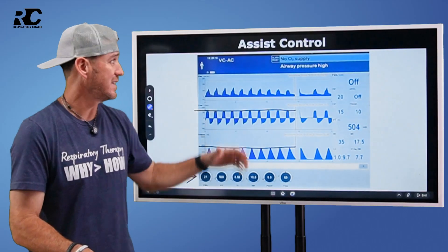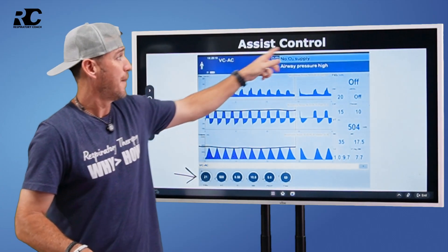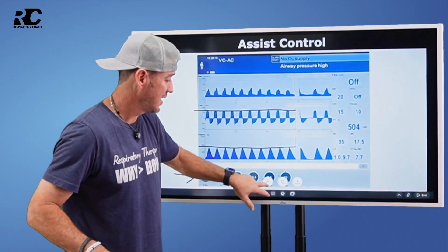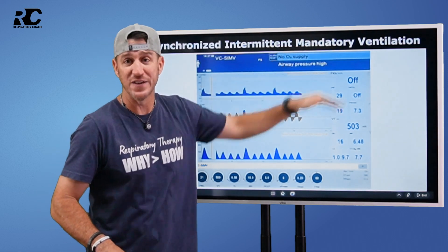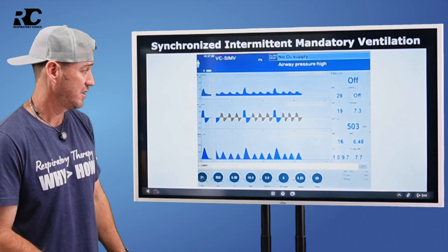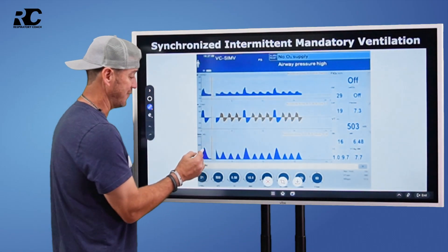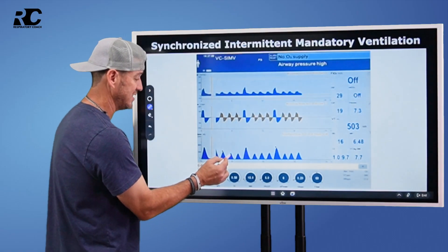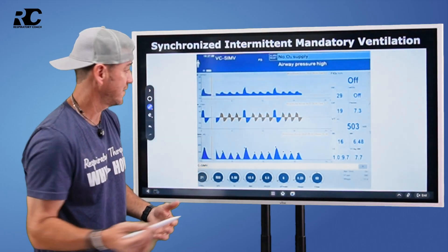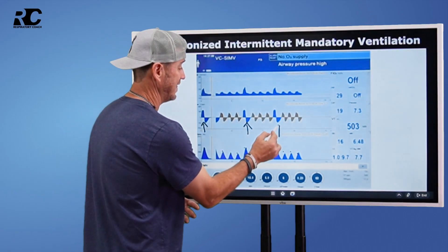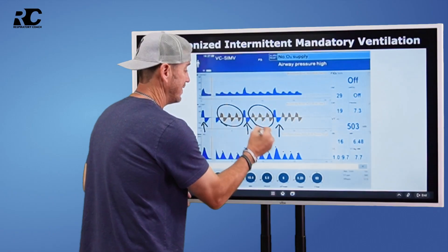Hopefully that makes sense. Think about the name — the vent says, oh, you want assistance, you want a breath? Okay, I got you, but I'm in control. Now watch what happens when we look at SIMV, which stands for synchronized intermittent mandatory ventilation. Look at this image — it looks different, right? When we look at this, what we find is we've got a volume here, a volume here, and a volume here. What's going on with these volumes? Why are they different than the others? Look at the flow pattern — these all look the same, but they look different than these other breaths.